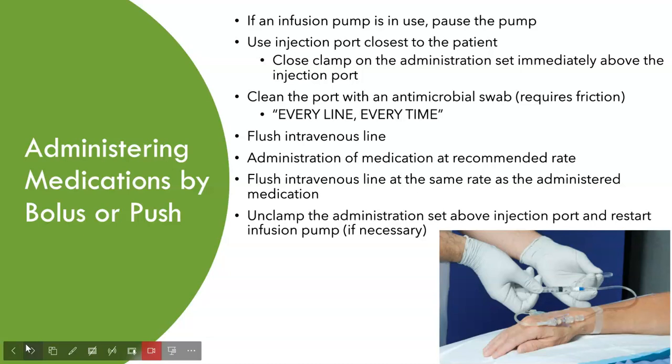If the IV push is not compatible with whatever medication or solution is running, then you definitely want to make sure you always flush before the medication and after the medication, which you should be doing anyways, but that's going to help prevent any chemical reaction from occurring from those two solutions coming into contact.